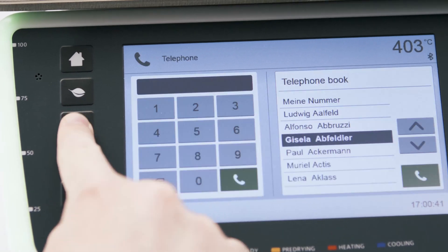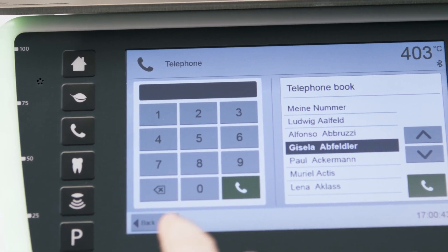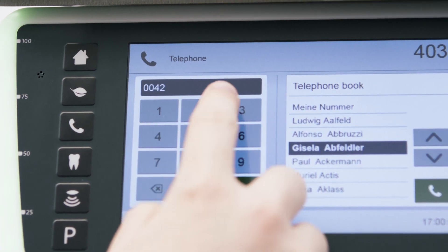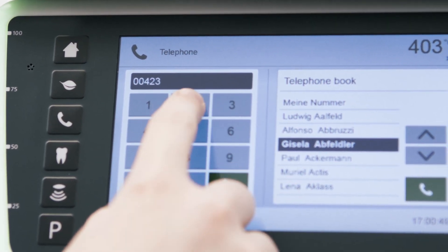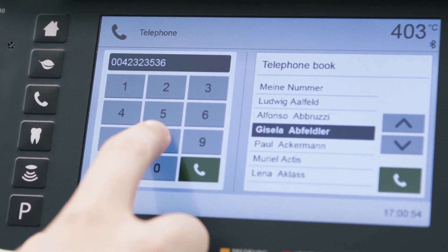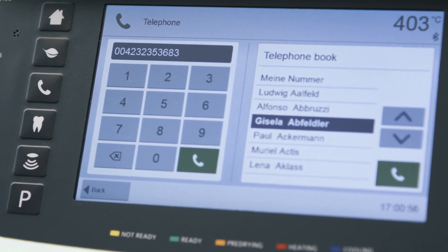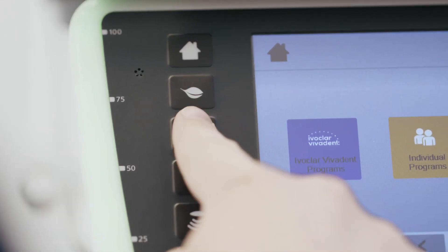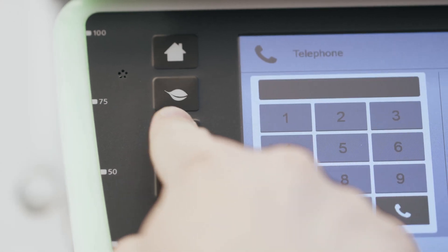If you want to make a phone call, press the phone key. The contacts that you have saved in your contact list on your mobile phone appear automatically on the display of the furnace due to the Bluetooth function. Bear in mind that your contacts only appear on the display if your mobile phone supports this feature. You can enter a phone number by typing in the number on the numeric pad or by selecting a contact from your list.